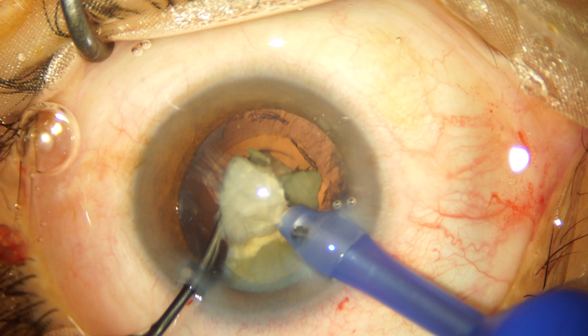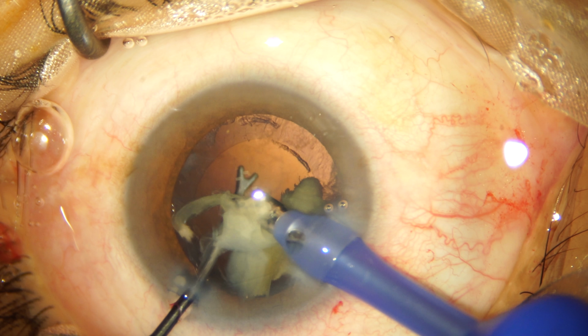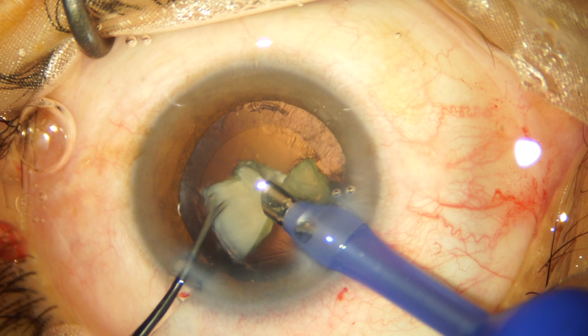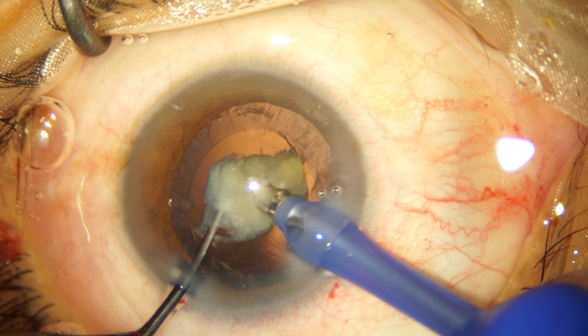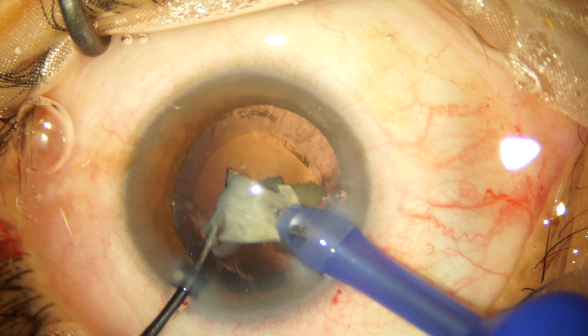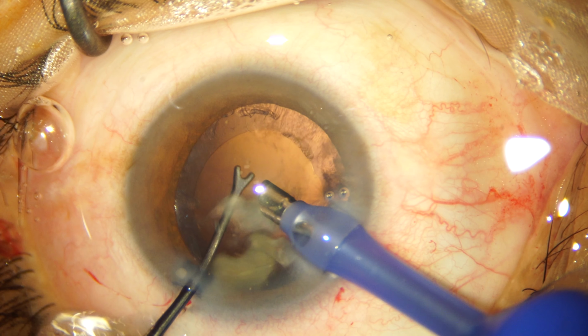I do so because the sharp chopper can inadvertently puncture the posterior capsule and cause a PC rent. Mature cataracts have a very flimsy posterior capsule for the reason that they've been stretched out by the increasing convexity of the nucleus, and hence they're thinner than normal.